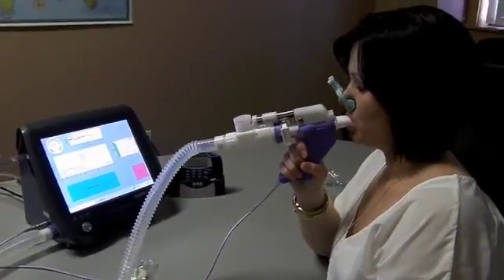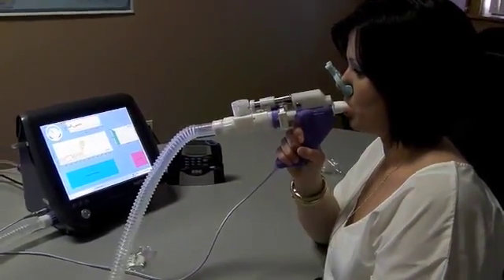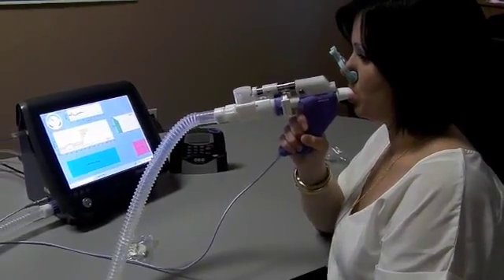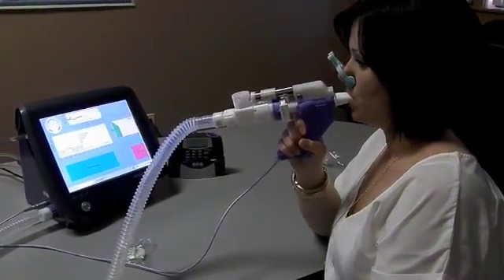She'll just continue tidal breathing, staying within her 1.5 flow range, 1.5 liters per second.